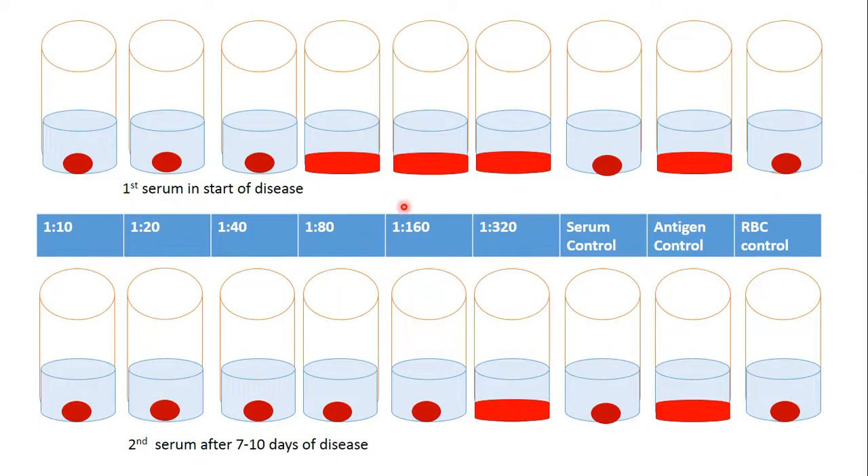Antibodies present in the patient serum against the influenza virus are capable of inactivating the virus in the viral antigen. There is no agglutination where a sufficient concentration of antibodies is present — we detect the result as a button. We check the dilution of the serum: 1 to 40.